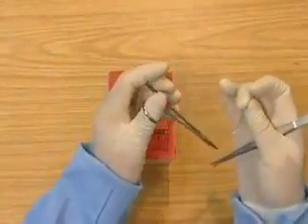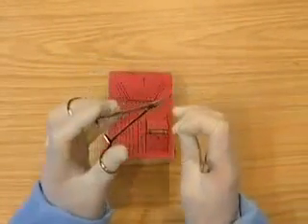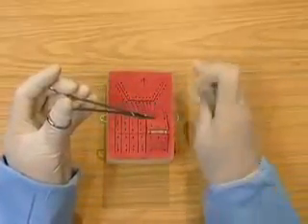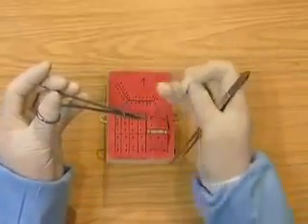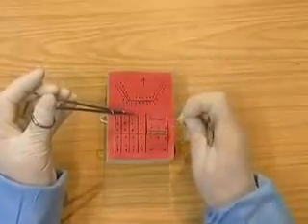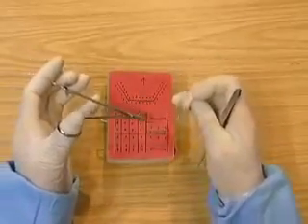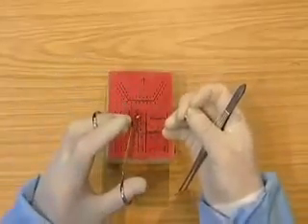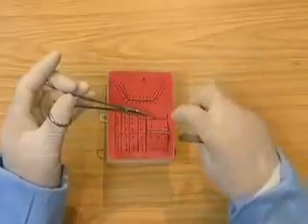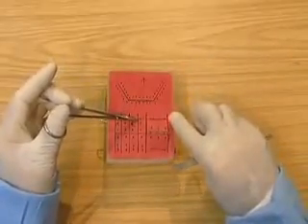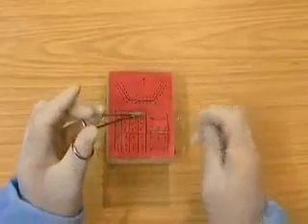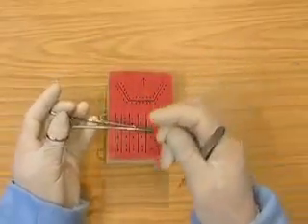Wind on, go under once, pull the knot tight. Over once, pull the knot tight and present it to be cut.